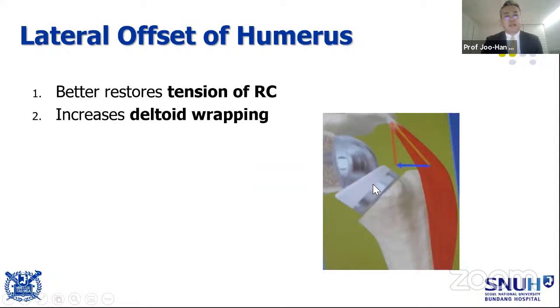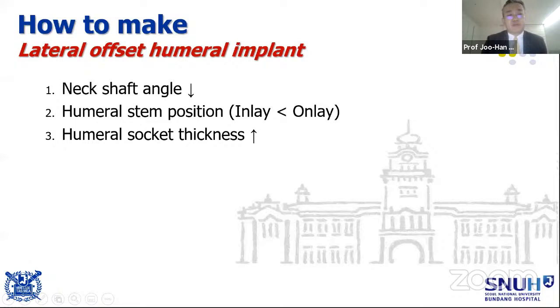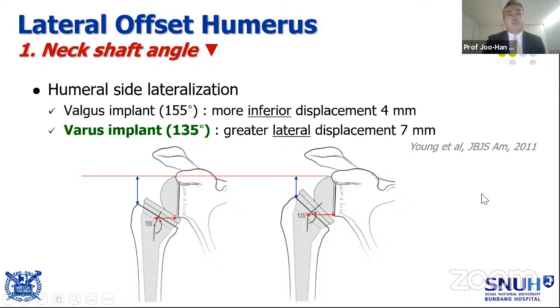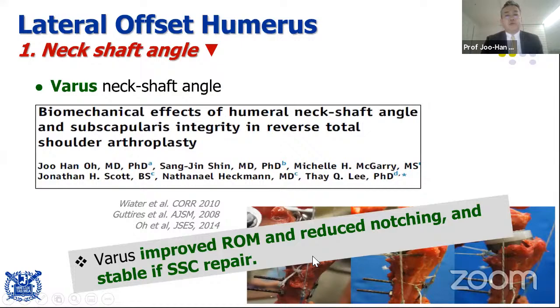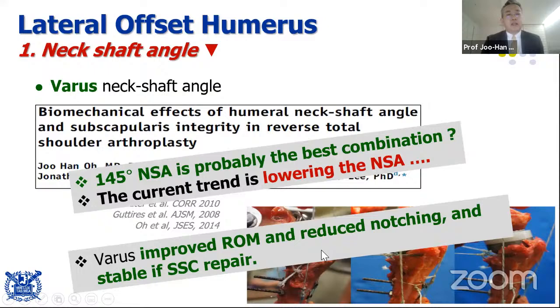With this kind of lateral humeral offset, we can probably restore the reverse cuff tensioning or increase deltoid wrapping in several ways. Number one, a varus implant. Instead of 155, we can put in 135. This causes more lateral displacement of the center of rotation. Several papers say that a varus neck shaft angle reduces notching and increases range of motion. But we don't know which neck shaft angle is the best. But as we said before, the current trend is lowering the neck shaft angle.